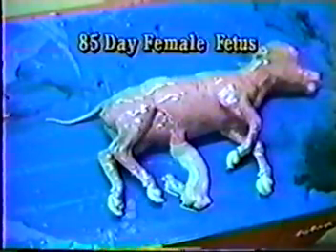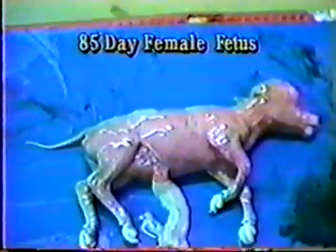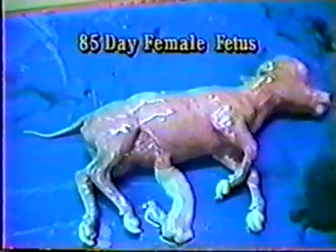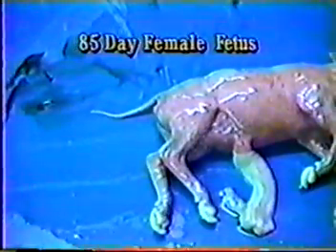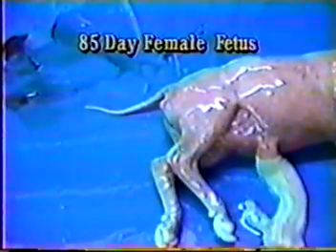This is an 85-day female in lateral view. Take notice of the dome-shaped head. The head is easily recognized and is an important landmark relative to orientation of the fetus during an ultrasound exam.